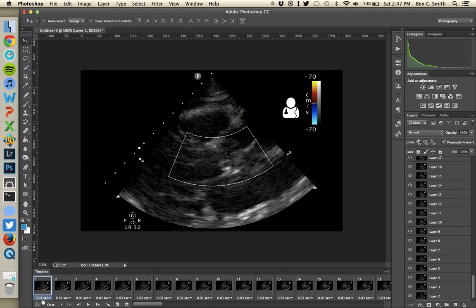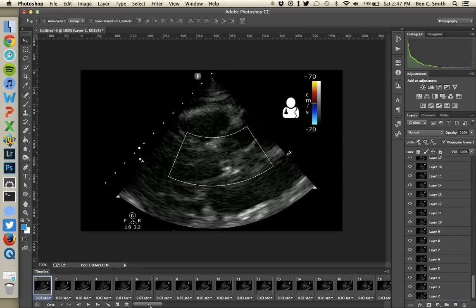Underneath each frame is a time value — that's how long that frame will be displayed in the GIF. This is a 30 frames-per-second ultrasound clip, which is a pretty standard frame rate, especially with color on. If you have a high-end machine, you may get 60 frames per second or higher, and you need to make sure the time is appropriate. For 30 fps, 0.03 seconds is the right time per frame — just do the division: one divided by the frame rate.